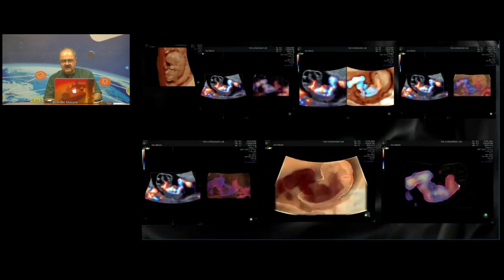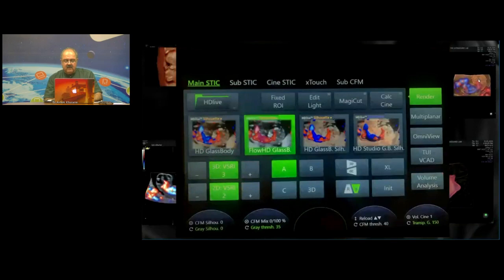And look how nicely you can actually demonstrate vessels going right up the neck of the fetus, and that's the beginning of the carotid system sitting right there. And if there's something wrong, you'll know that yes, there is indeed something wrong right there at this very, very early stage. What I was mentioning was this, that we no longer have to sit and remember what does what. I have a touch screen which knows that there's stupid people like me handling machines like this. And do you want an image like this? Okay, I press, I get that.